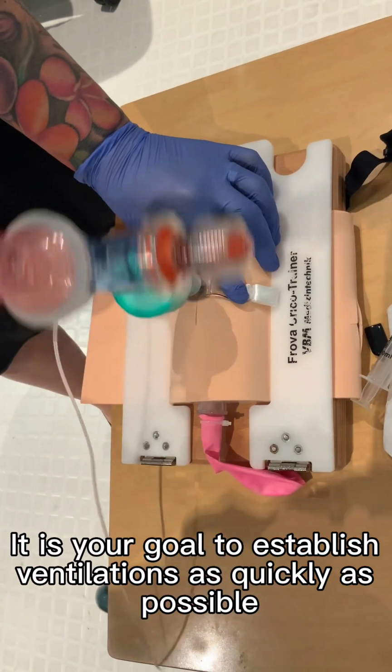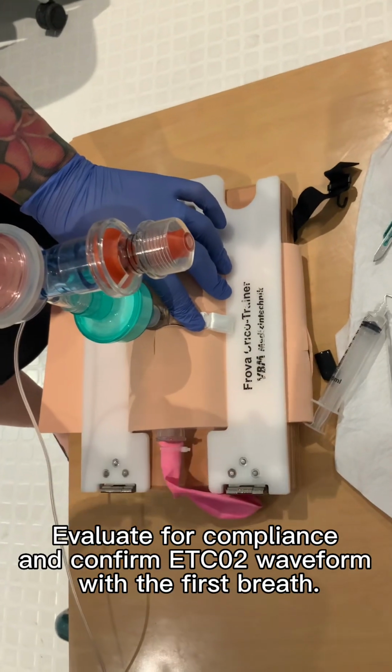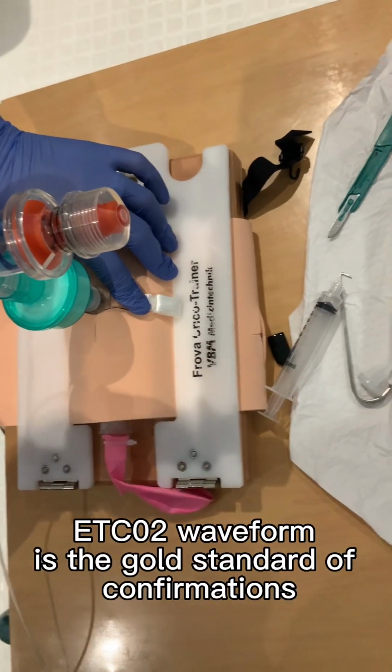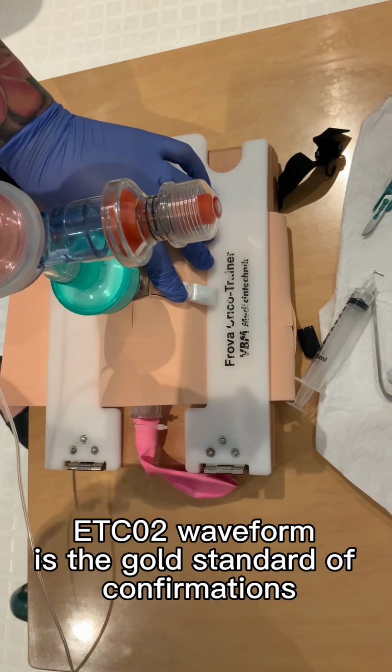Provide the first ventilation as quickly as possible. You should evaluate for an ETCO2 waveform with the first breath. This is the gold standard of confirmation with a surgical airway.